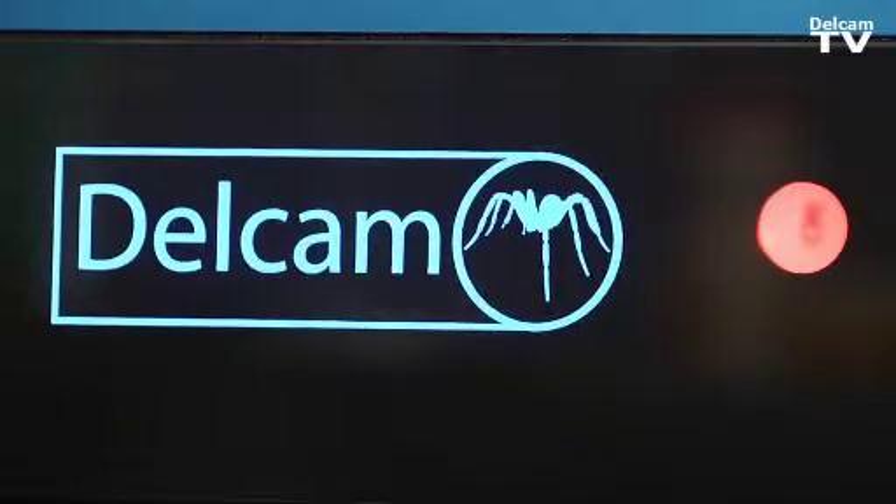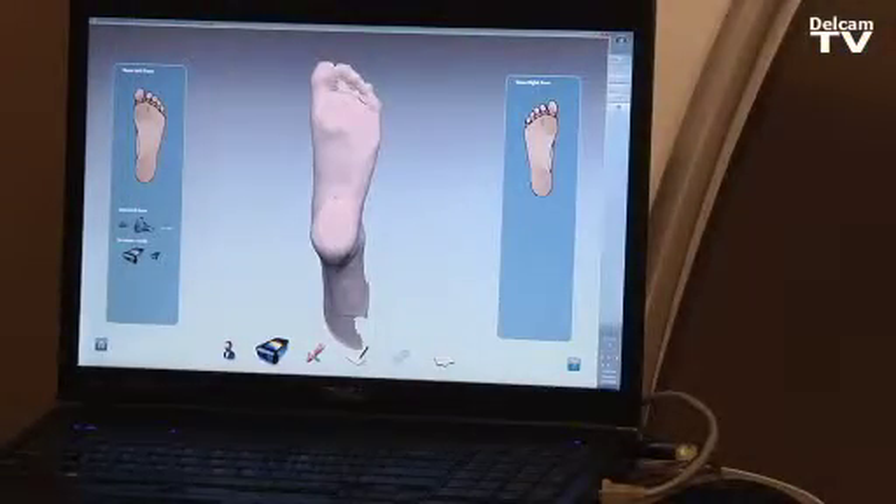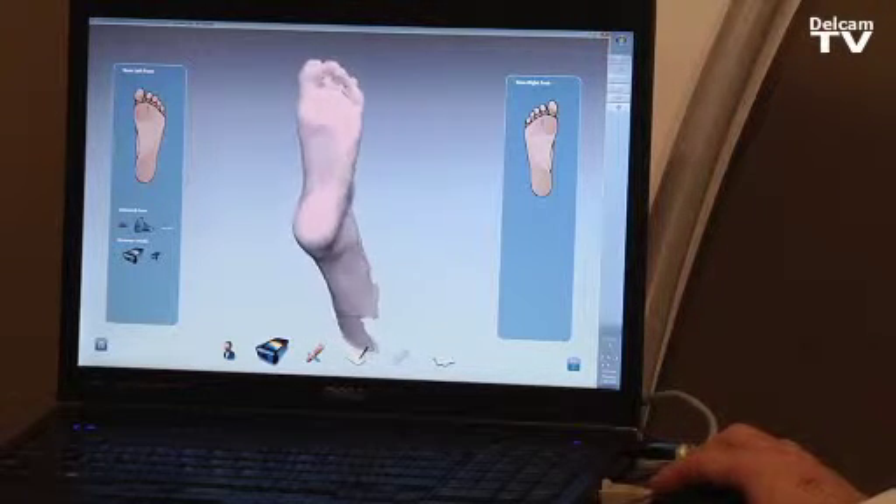The iCube scanner will take a 3D image of the foot and also a 2D picture of the foot to check for calluses and ulcers. So now we have the semi-weight bearing image of our patient's foot.